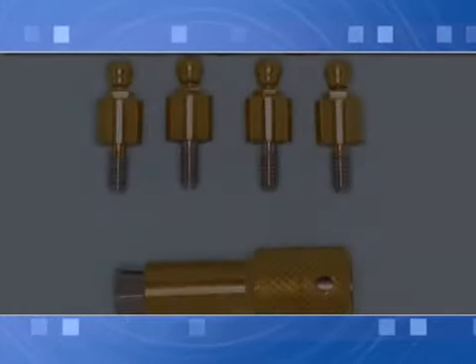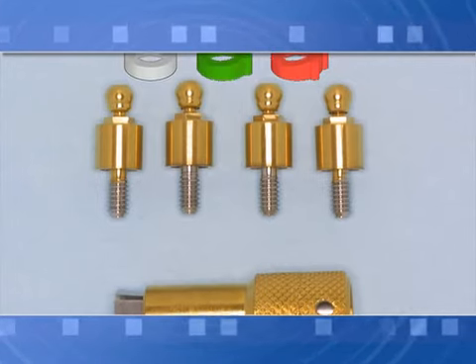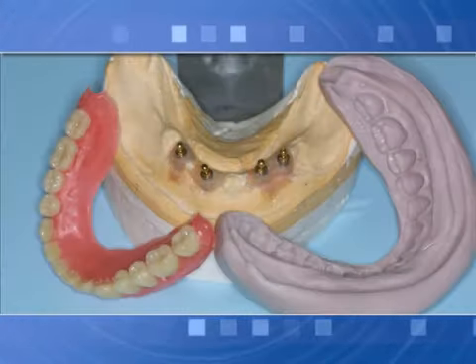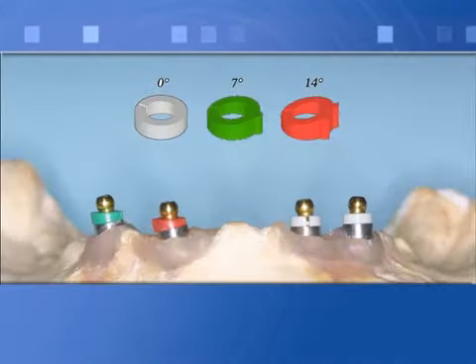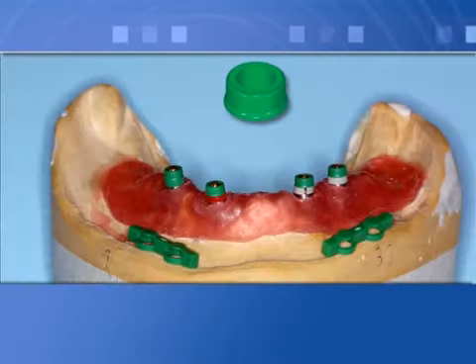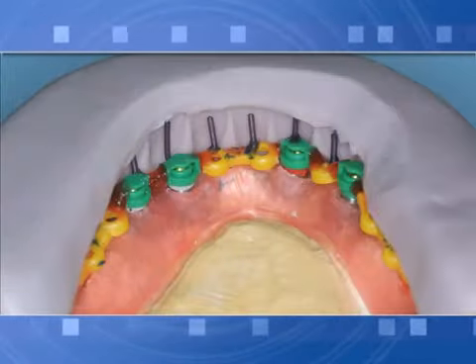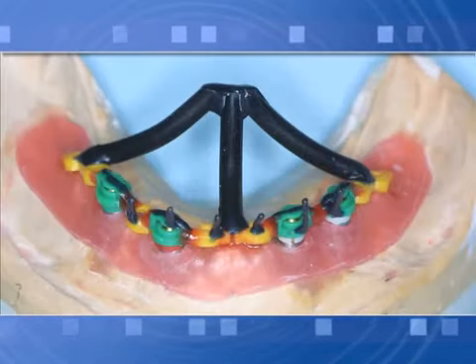Finished denture. Lab procedures. After the denture with waxed mount has been tried in the patient's mouth, make a trial mask on the model in order to check the spaces available to work. Using OT box castable components assembled together, it's possible to create cast reinforcements directly on master models without the need of investment duplication. Use of the trial mask helps to fix retentive pins in proximity of frontal teeth.